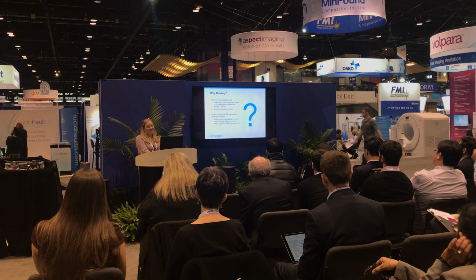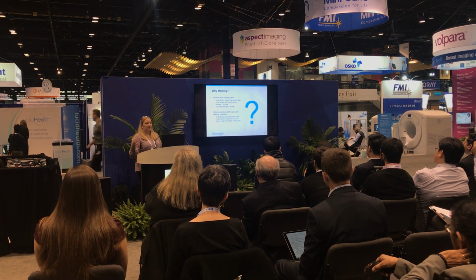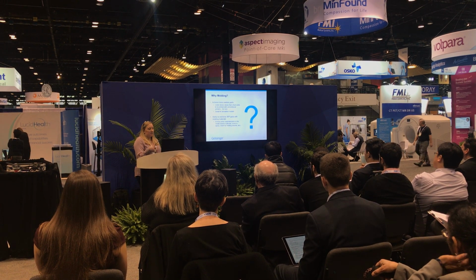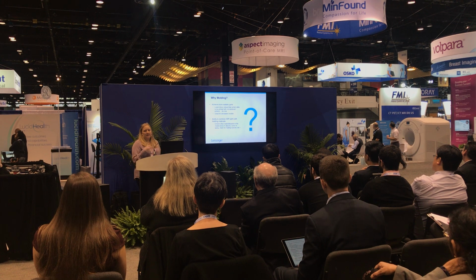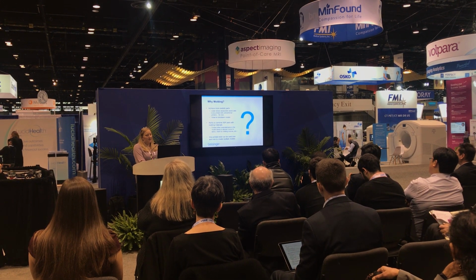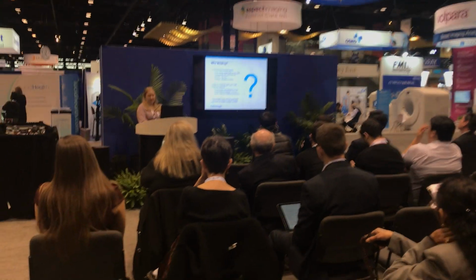Another good thing about molding is the ability to combine 3D printed parts in with the molds. So you can do 3D printed bones in with silicone, tumors and epoxy. We even put mesh in some skin layers so it holds sutures. And the really good thing about molding is one printed mold can make multiple simulation models out of it.